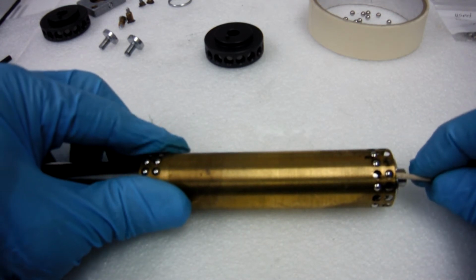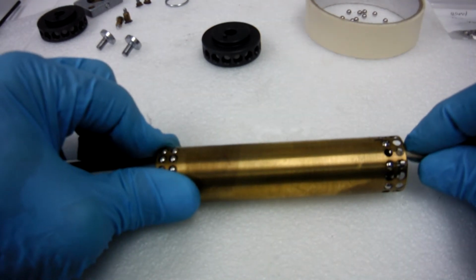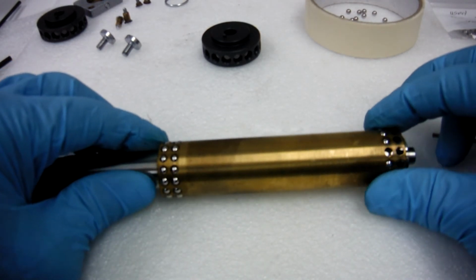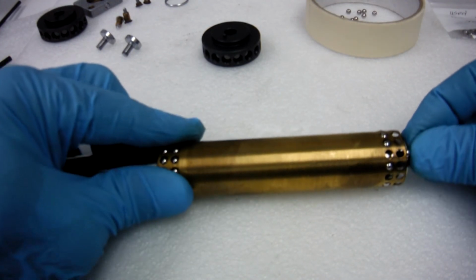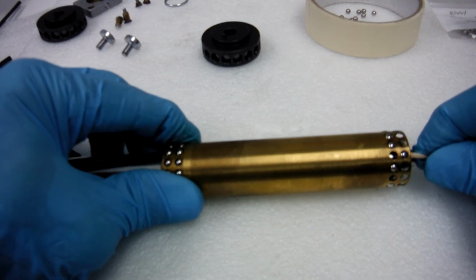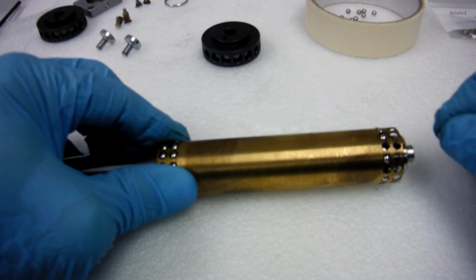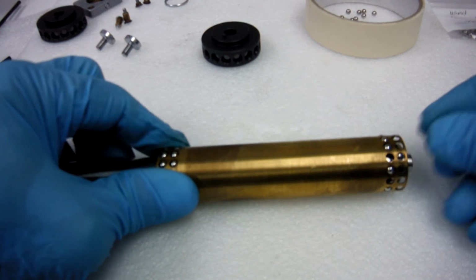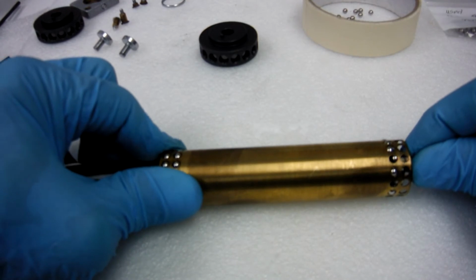Basically, you keep doing this, and once you have the first row in, then you would do your first row. I'm about out of battery on my camera, so you may lose me, but you get the idea. You have to concentrate.